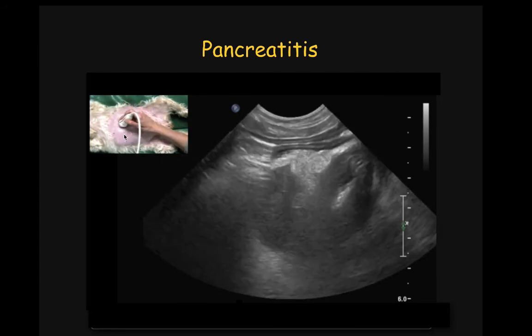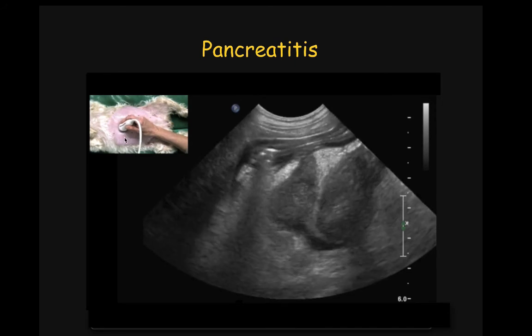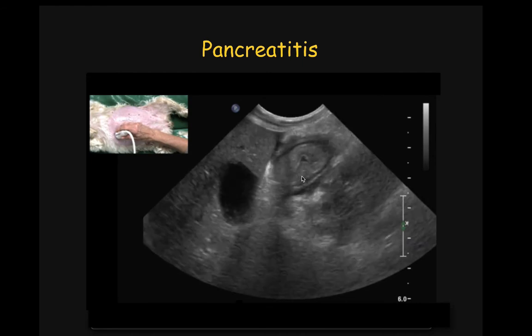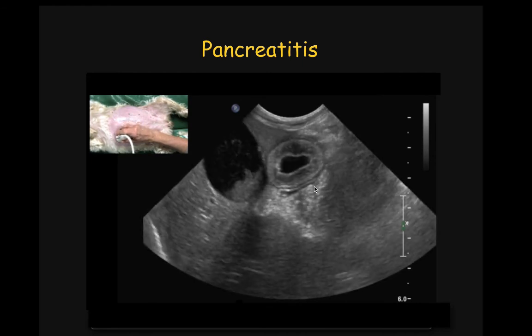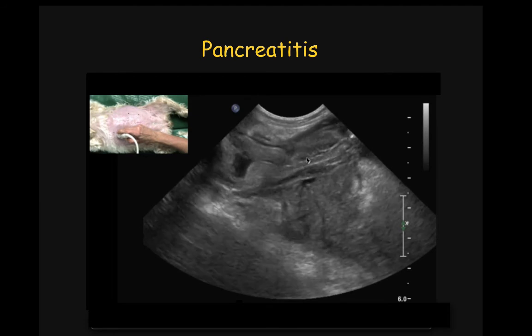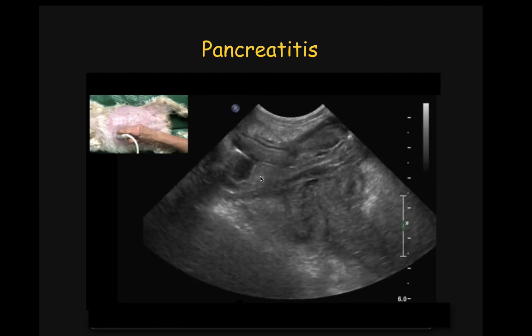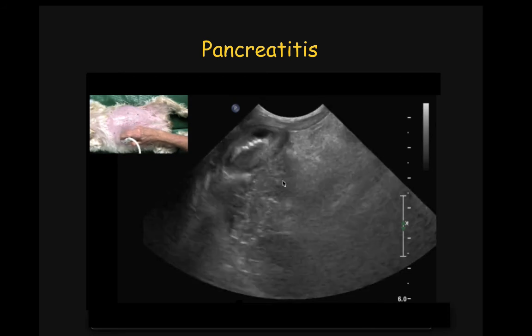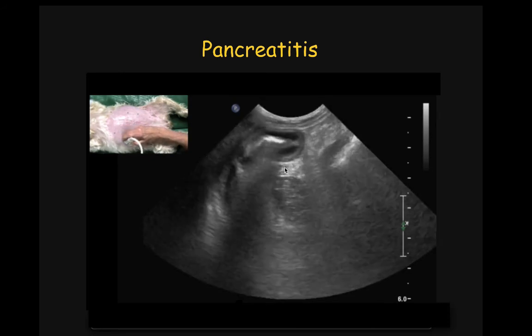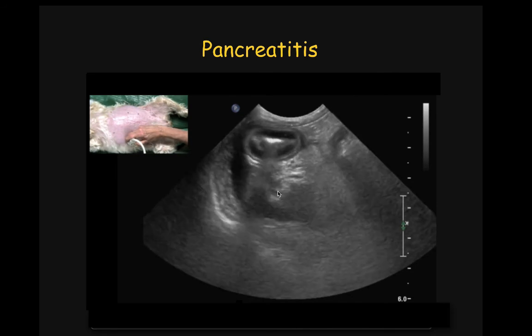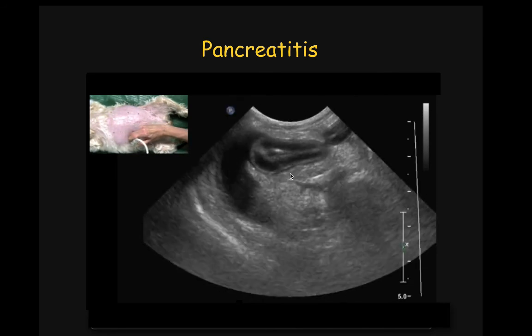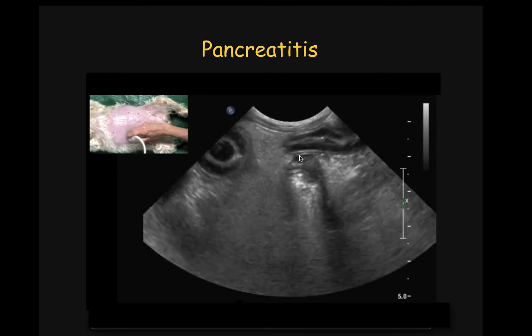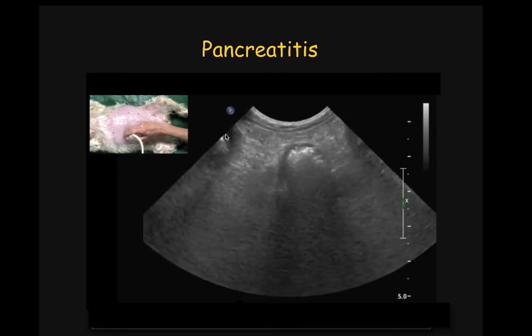Moving back to the region of the body of the pancreas, we see again abdominal effusion, hyperechoic fat, altered layering of the duodenum, and the mucosa is really hyperechoic to normal. Along the right limb, there is an enlargement of the pancreas surrounded by hyperechoic fat. Here is the colon and the duodenum.